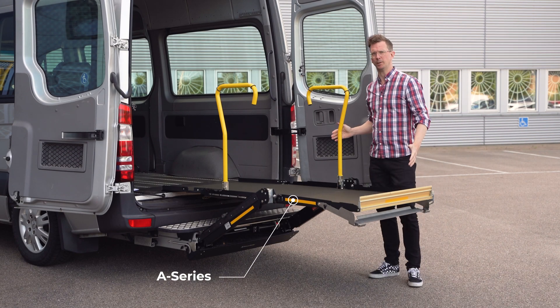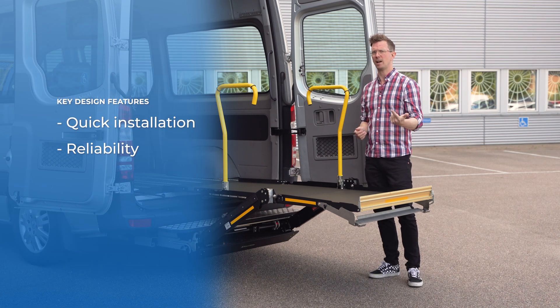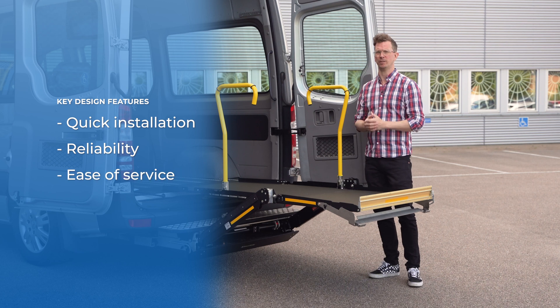This is the BraunAbility A-Series, a strong but lightweight wheelchair lift. Its key design features lie in quick installation, reliability and ease of service.